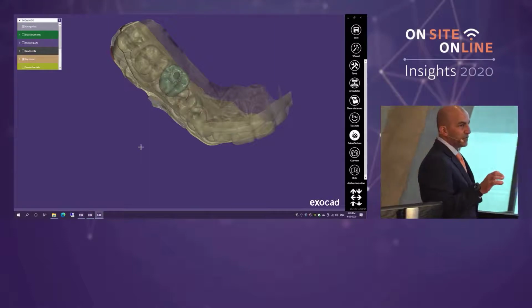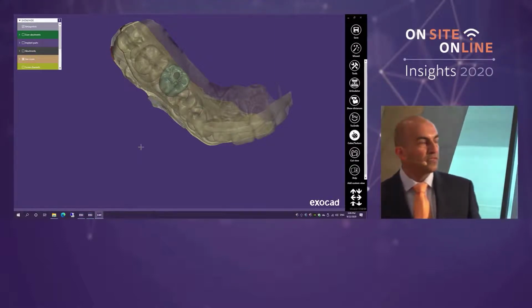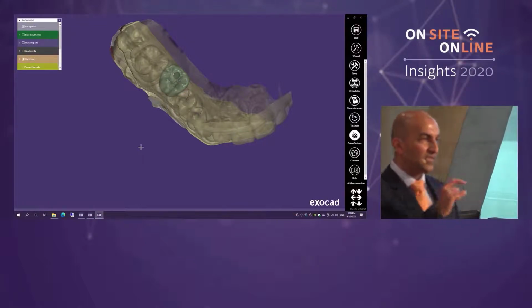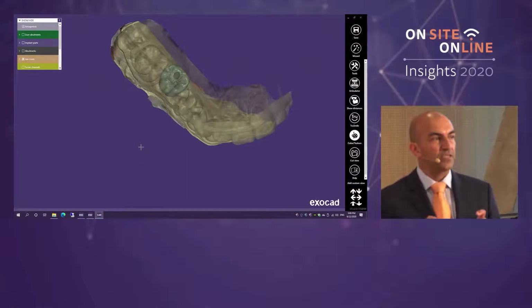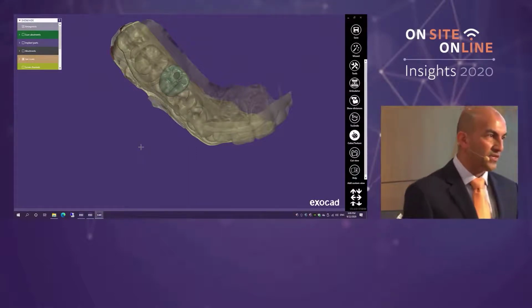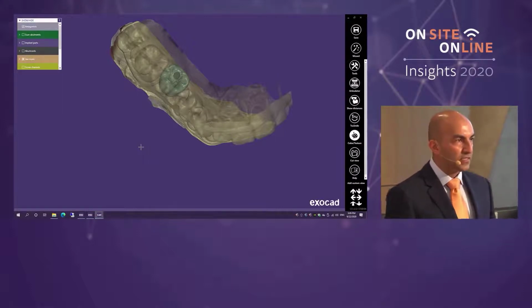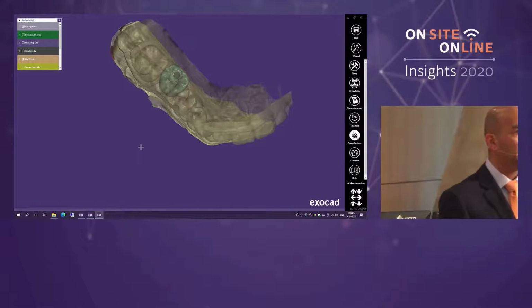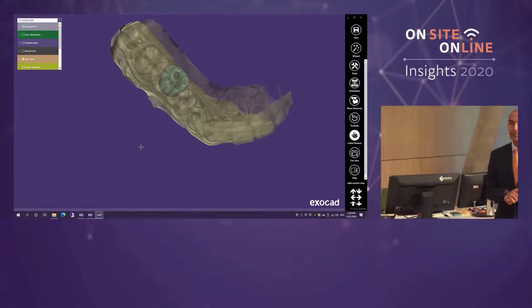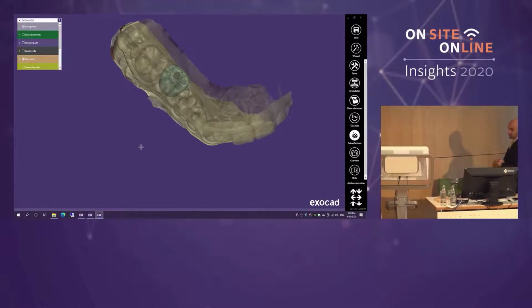The software is powerful, believe me, it is, and you can run away with it. So when I teach chairside CAD-CAM to any new users, the last thing that we teach is a few elements of expert mode, and then we leave them to get on with it and do 30, 40, 50 restorations, and then as a reseller they'd ring me and say, right, I'm ready, let's take it to the next level. Okay? Any other questions from the room? Anything from online, Michael? Okay, in that case, we are going to switch things up and move to Exoplan.